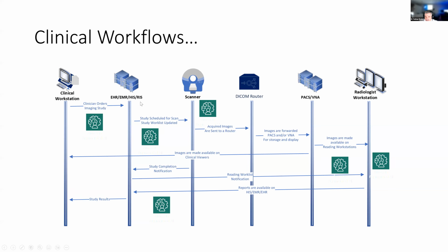This can be similar in the pathology setting too. So even though I'm talking about radiology, I'm sticking with one story, but you can easily replicate this flow in a pathology setting as well. When I say pathology, I'm referring to digital pathology, by the way.